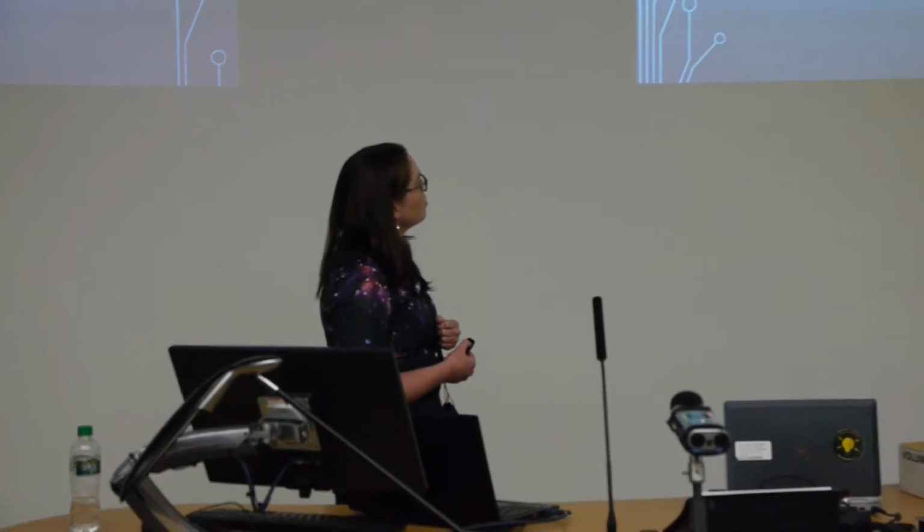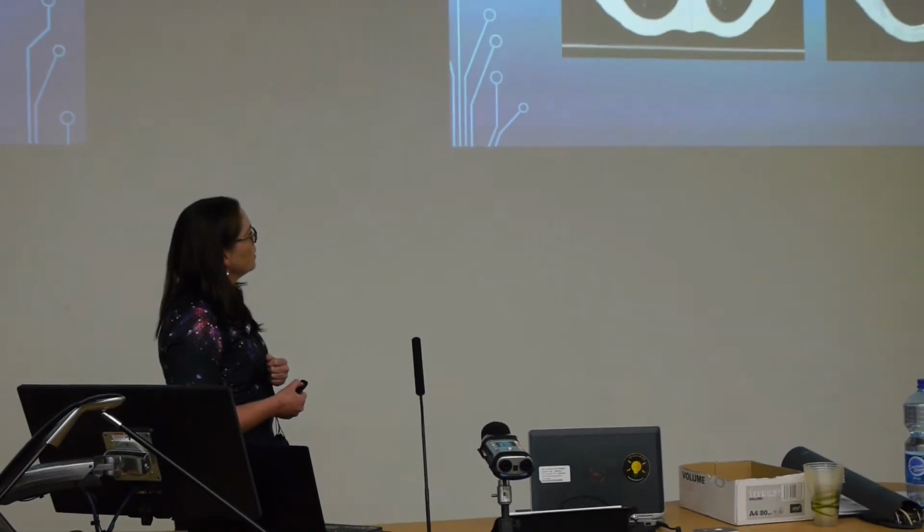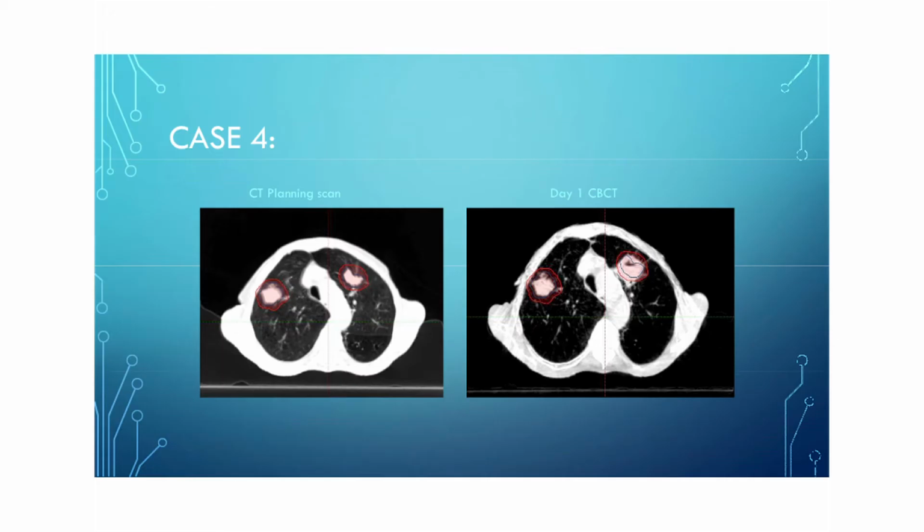This is another example of progression. So we have 2 tumours here. This one looks pretty much the same. This one looks a lot different. So you can catch that on day 1 and go back, replan.